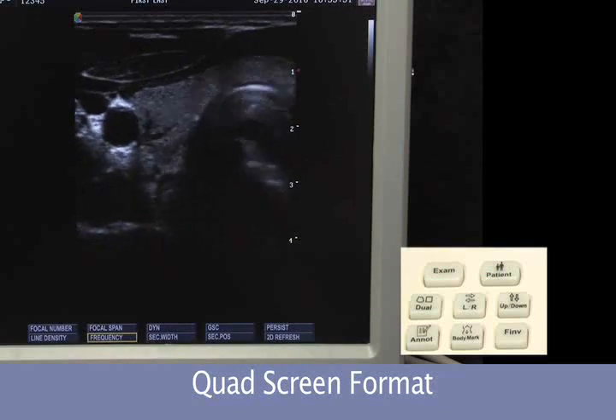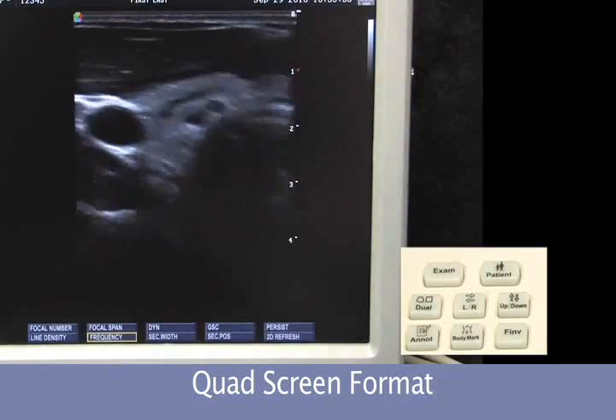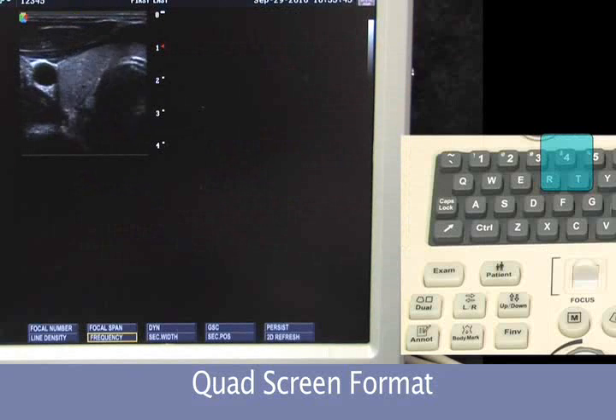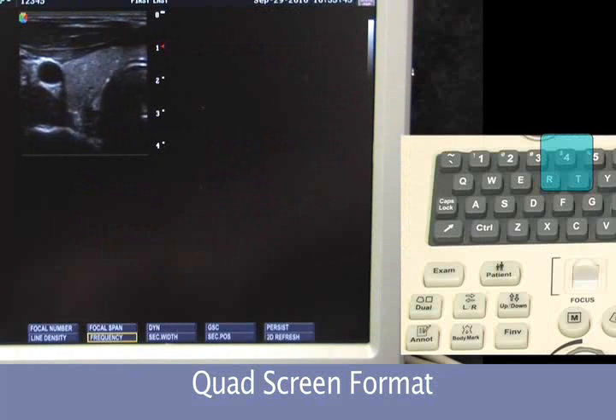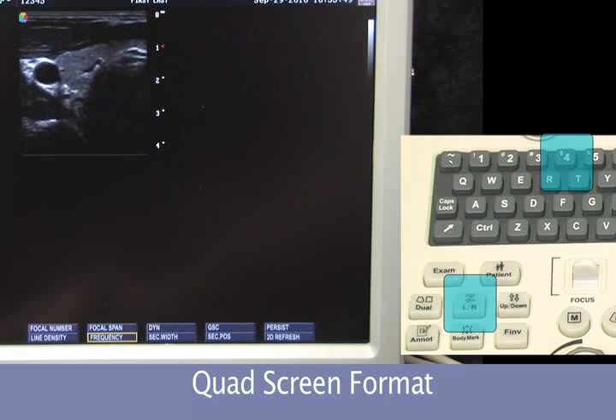We can also review in a quad screen format. This will be used for our stress echo as well as general imaging. If we hit the number four button as a hot key, we'll come up and toggle between the images the same as we did on the dual screen, hitting the left-right key.